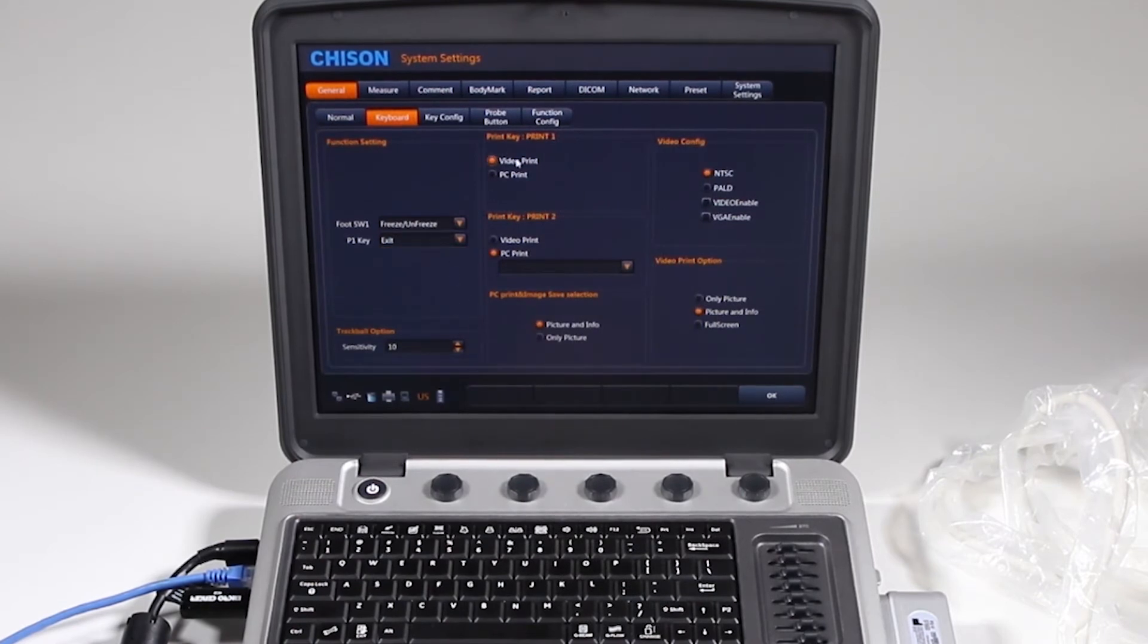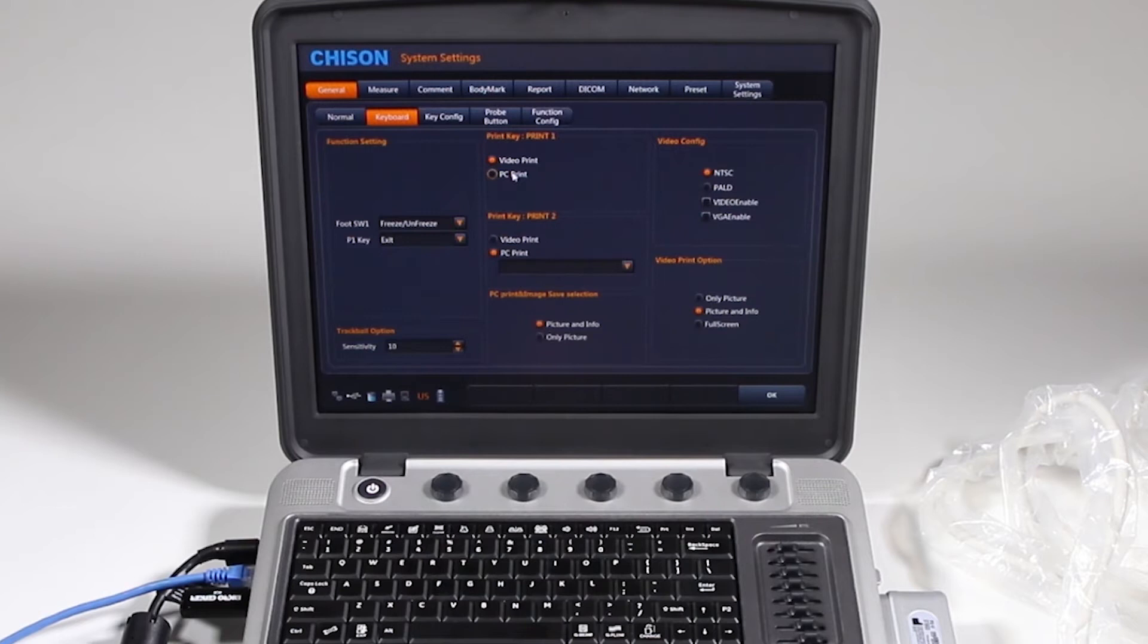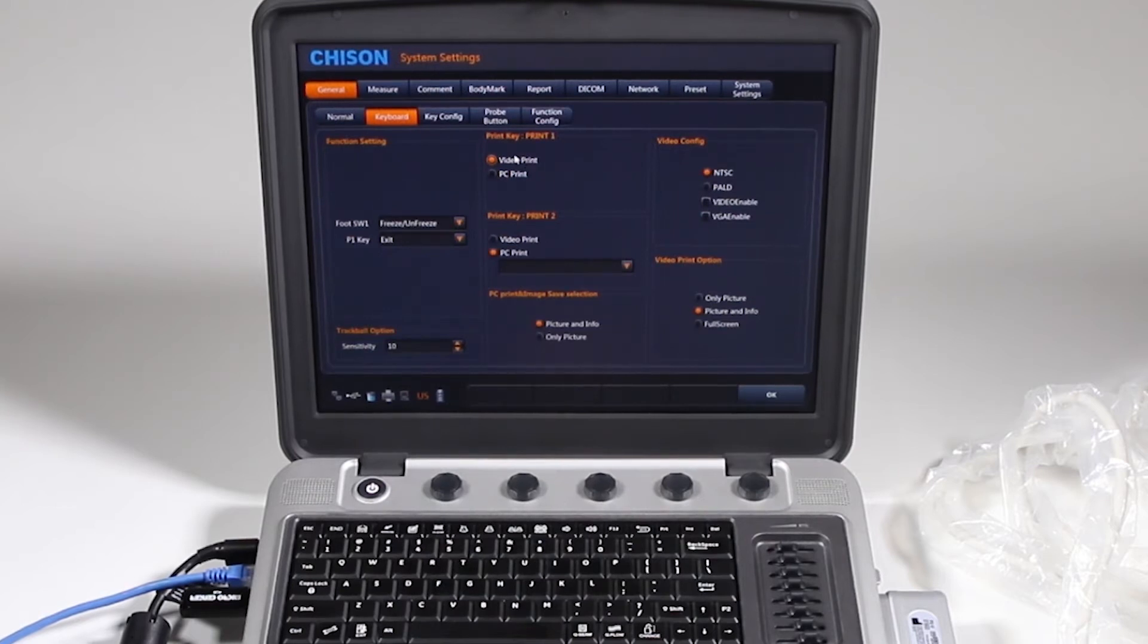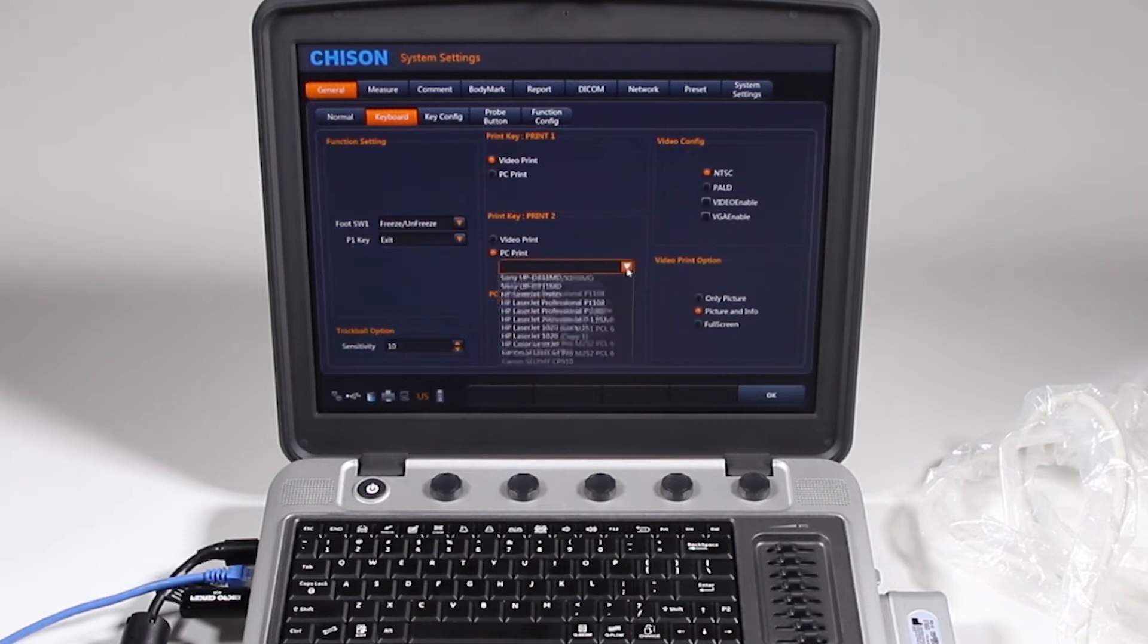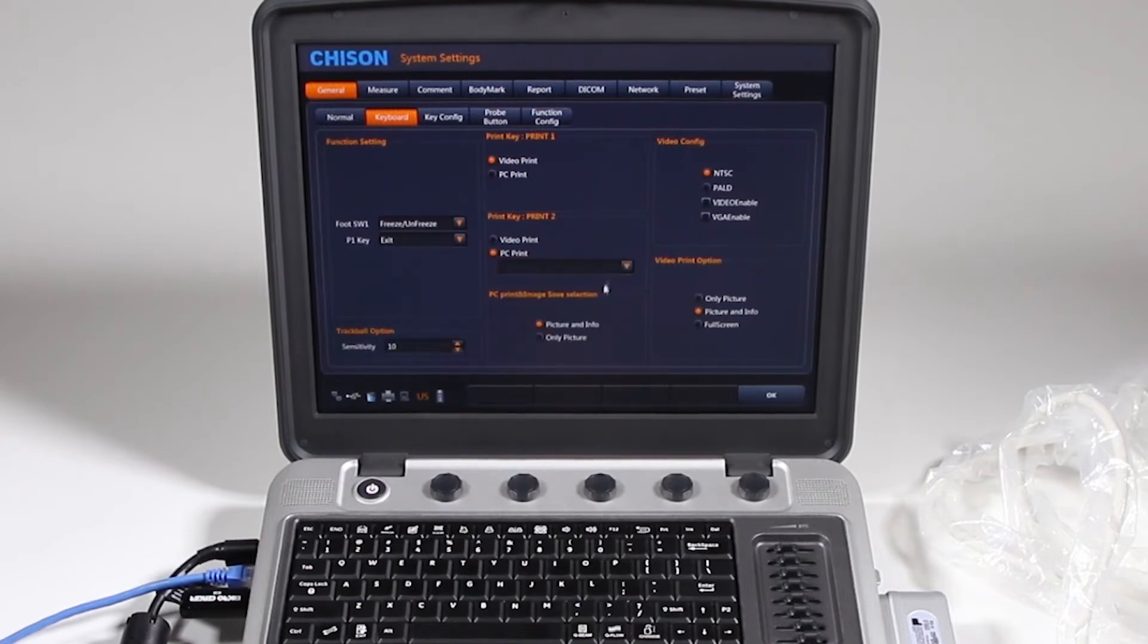Track ball sensitivity, print 1, do you want to go to a PC printer or like a black and white thermal printer? Key 2, same thing, and you can choose your PC printer here.